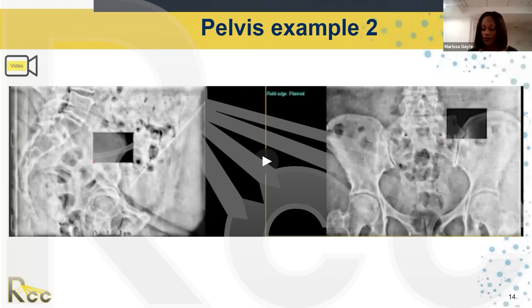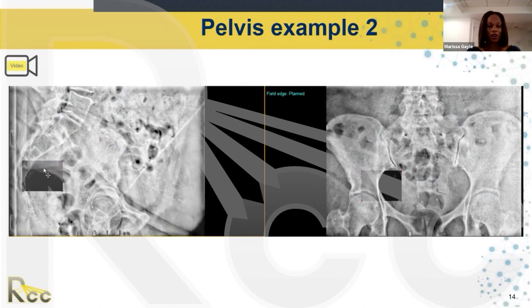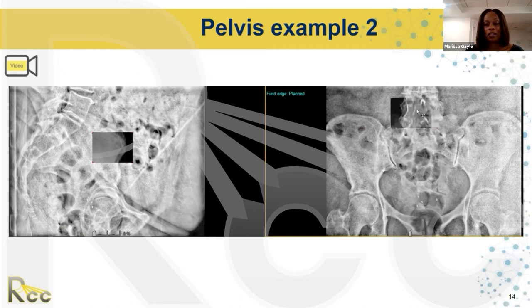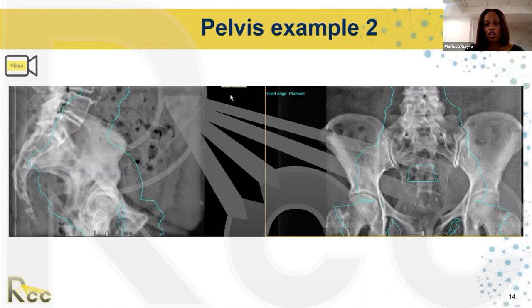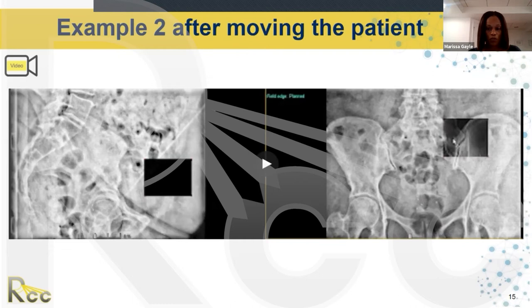We have another example, Pelvis Two. Playing it — the therapist is checking the sacrum and lumbar spine, checking the pubic symphysis, and there's a slight superior-to-inferior shift needed. On the AP film, they're checking the pelvic brim, the femoral head level, the spine, and the iliac crest. They then put on the actual contour — showing where we need to treat — and confirm everything that needs to be treated is within that blue contour.